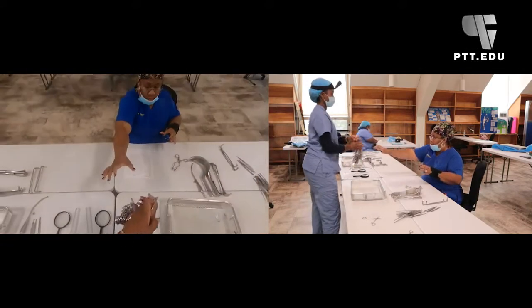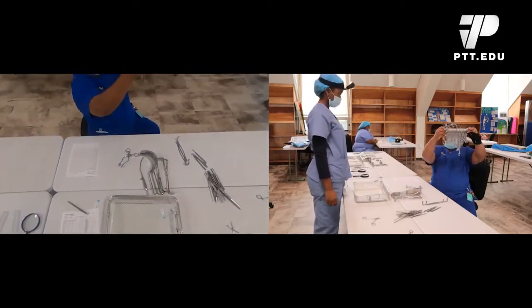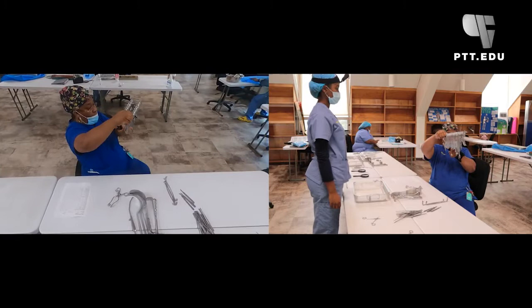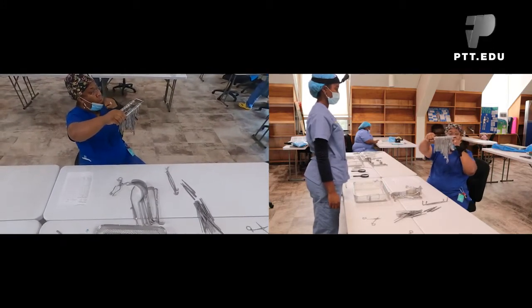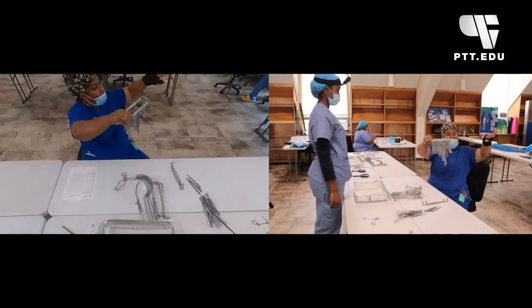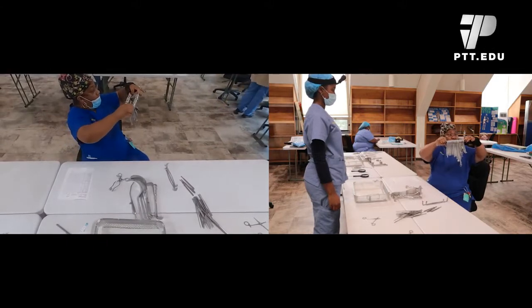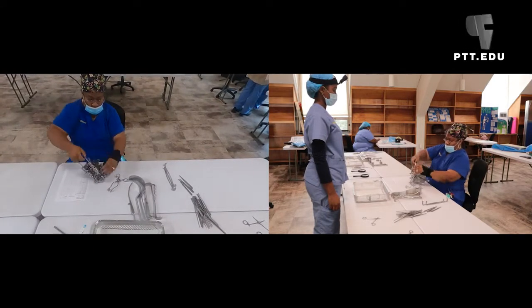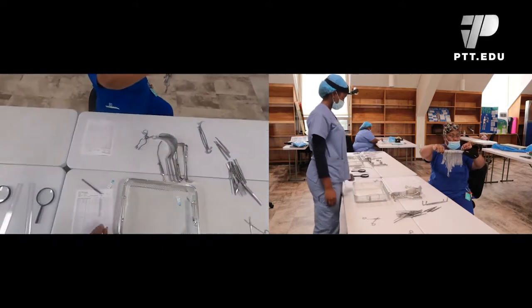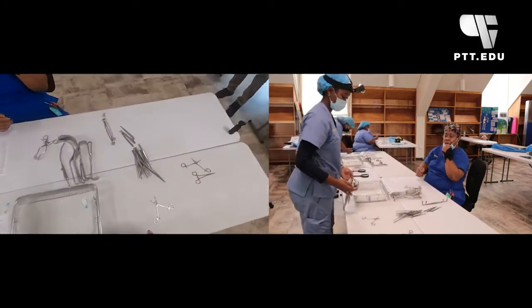Now earlier I asked, I'm going to hold this up like this. Now as you can see, there are a lot of curved instruments that are going to my left, that are these and these. So the rule of thumb is always have your curved, strong instruments going in the same direction. So it doesn't matter if you hold it up, don't want them to fall on the floor. Doesn't matter if it's held up like this, or if you hold them up like that. They're still all going in the same direction. So it just makes the aseptic technique more appropriate.